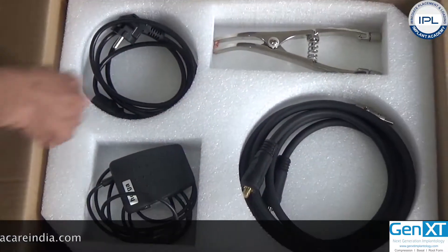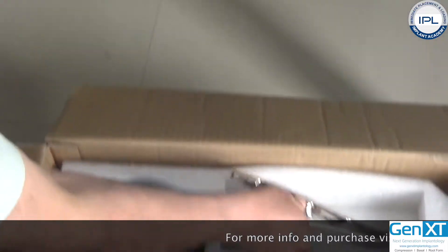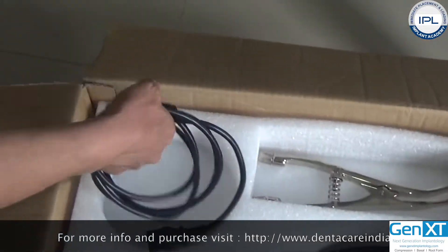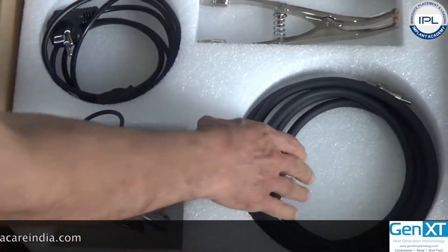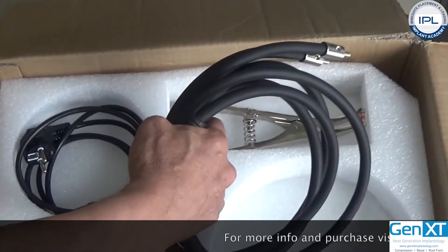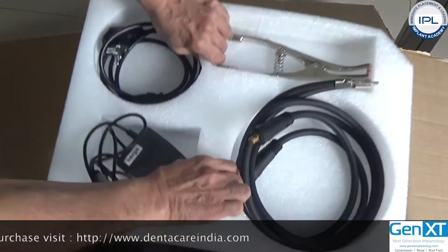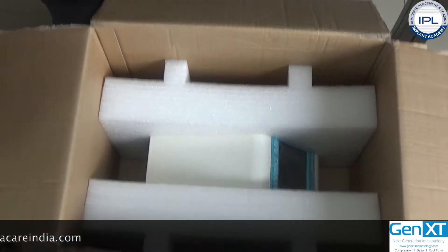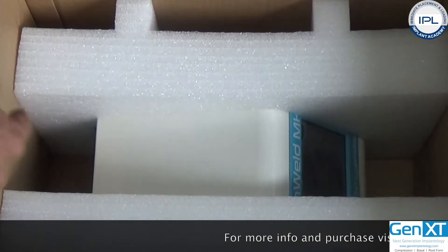This compartment is the handgrip for welding. It has a power cord, a foot switch, and the cable to connect the handgrip to the machine. After you remove this compartment, there is the welding machine, which we will remove at the end.